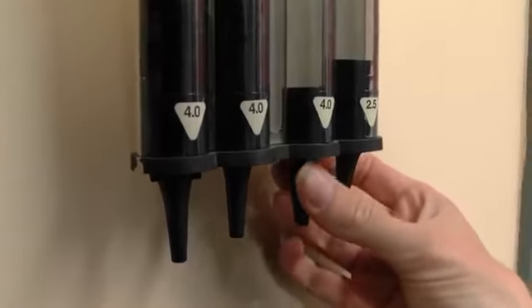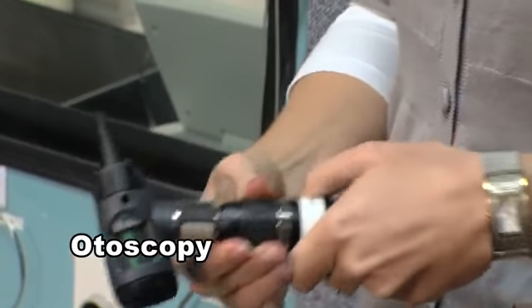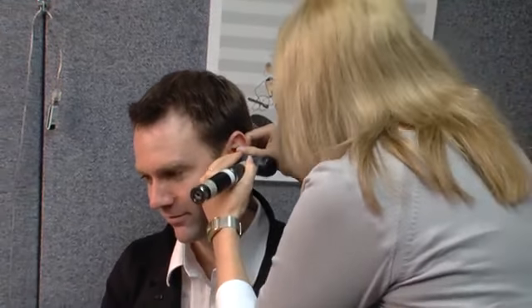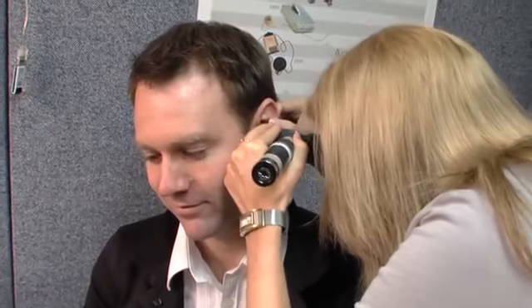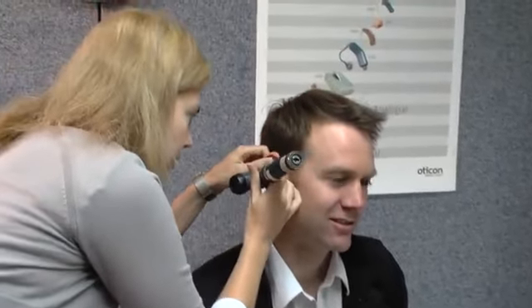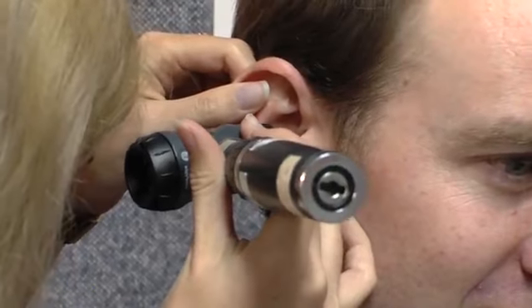So what we'll do is I'll just have a look in your ears for a start and then we'll get on with the hearing test. Important clues about some conditions that may affect hearing can be obtained through an otoscopic examination of the client's ear canals. Good. And we'll just check the other one. Otoscopy also establishes whether the patient's ear canals are sufficiently free of wax or other debris to proceed with testing.